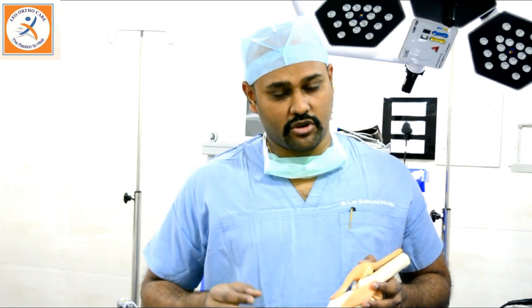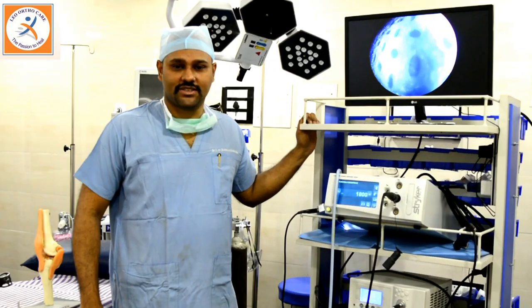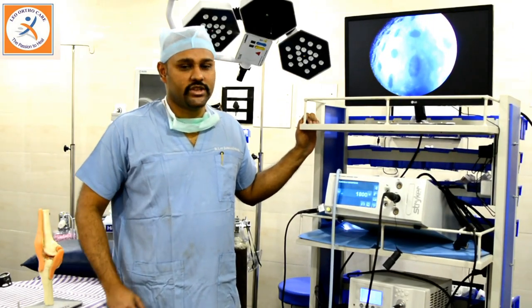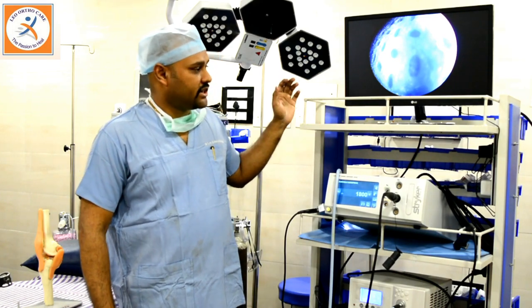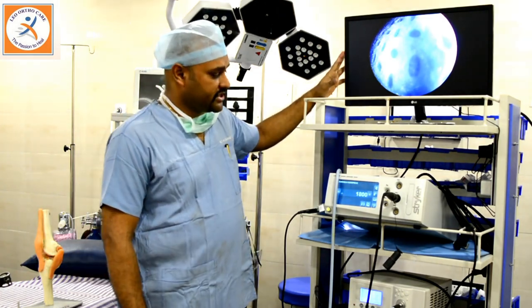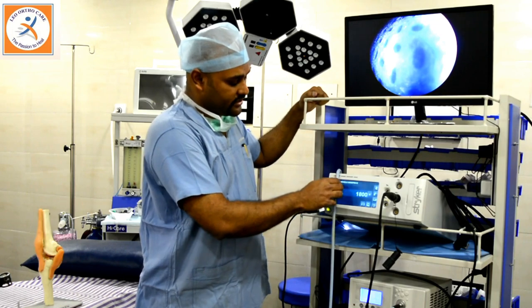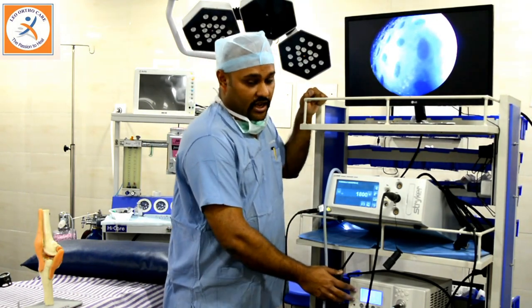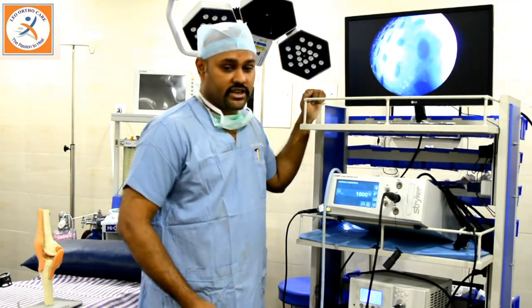Return back to normal life is also quicker when compared to open surgery. For arthroscopy we require some high-end machinery which is not available in all orthopedic centers. The machinery consists of one high-resolution monitor, a core console or shaver system, a high-output LED light, and the 3-chip camera.